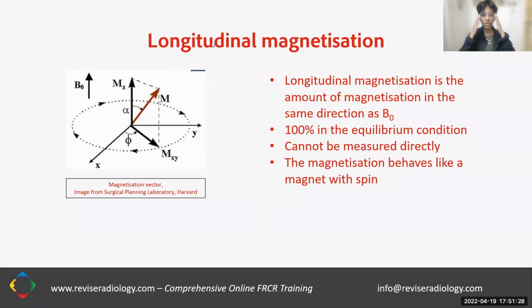Okay, so we've looked at what is producing the signal. We know that the magnetic field is applied, then the radio frequency pulse is applied, then resonance happens, then the protons will emit another radio frequency signal. Now we need to understand, okay, so we have this radio frequency signal. What does this actually tell us about the tissues that we're looking at?